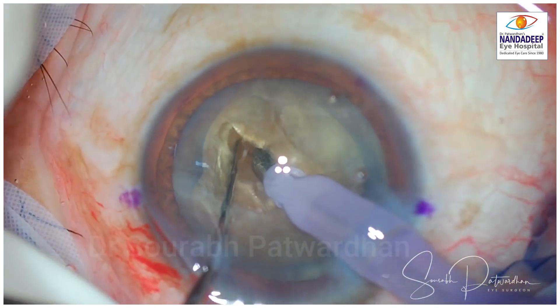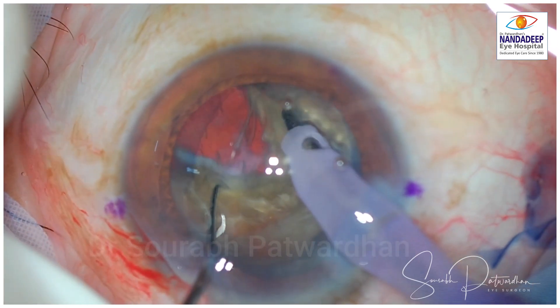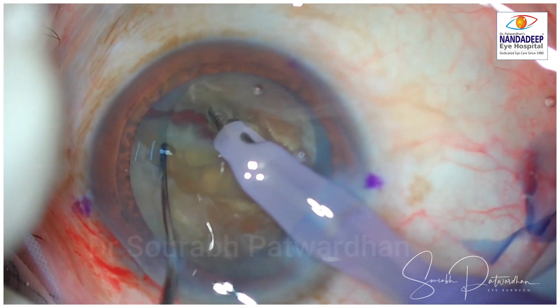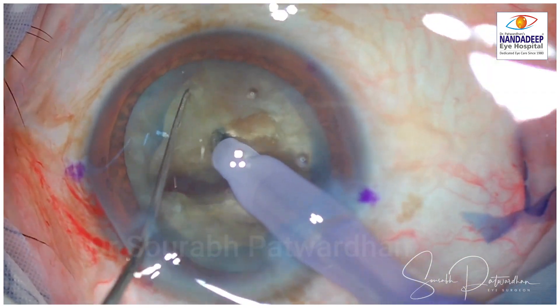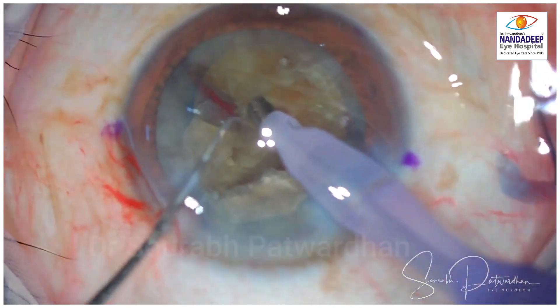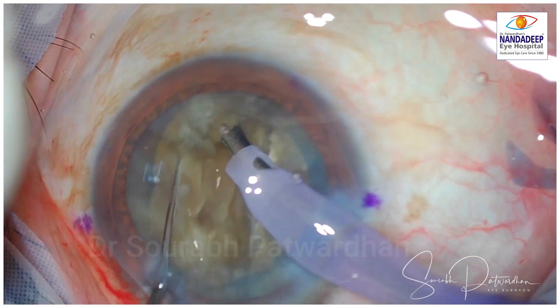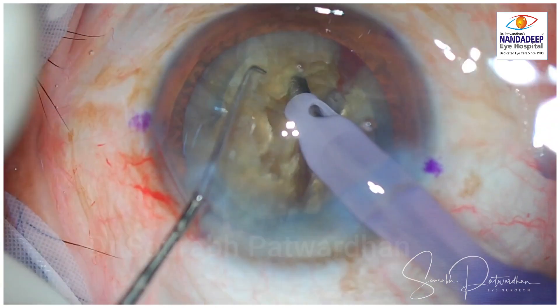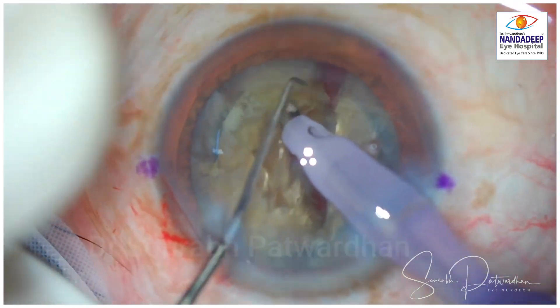A deep groove is made initially — this is a hard cataract, but as you can see it is a brittle cataract, not the leathery one, so I can crack the nucleus into pieces quite easily. I am using a combination of ozil and longitudinal pulses to get a good grip and crack the nucleus into smaller pieces. I will try to make at least 3 to 4 pieces of each hemi-nucleus — more pieces is better, as it will reduce the amount of phaco energy used. Make sure the endothelium is well protected using dispersive OVD; my choice is Hyalucoat, which is a combination of chondroitin and hyaluronate.